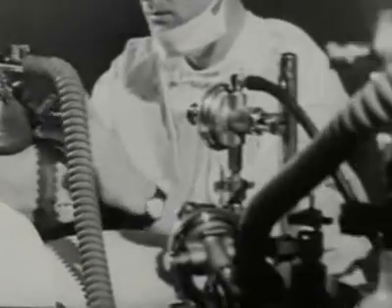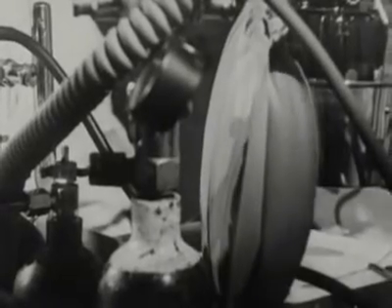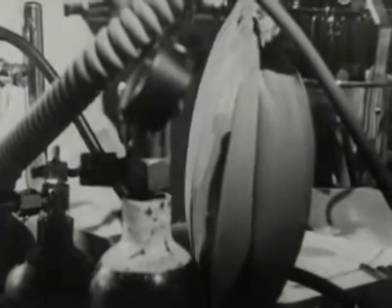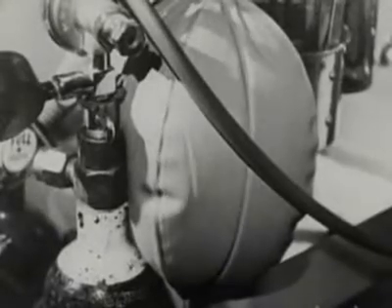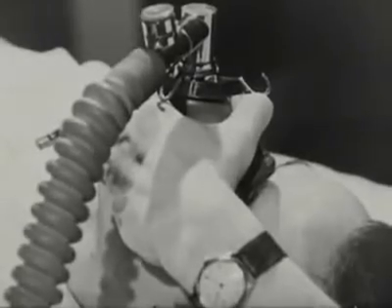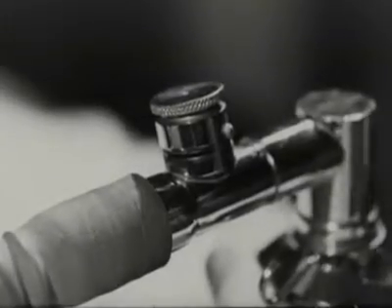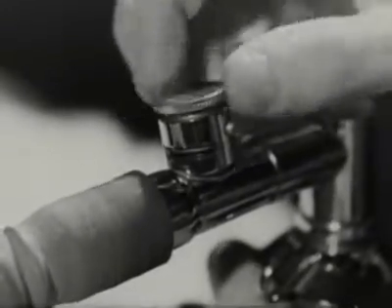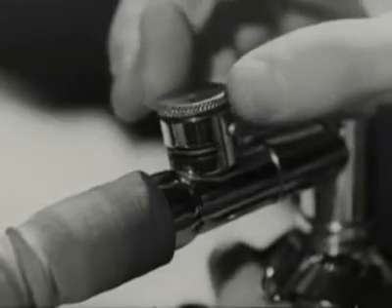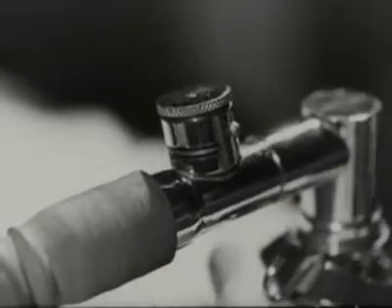As the mask touches the face, the rebreathing bag gradually fills. When it's full, the valve blows off at each expiration. The tension of the valve can be adjusted if necessary. A little positive pressure helps at this stage, but may tire the patient if it's maintained too long.